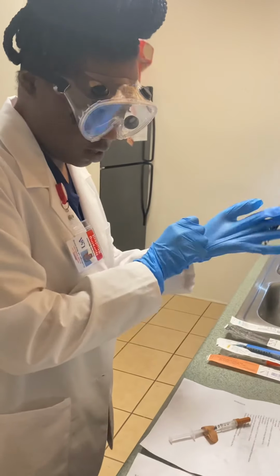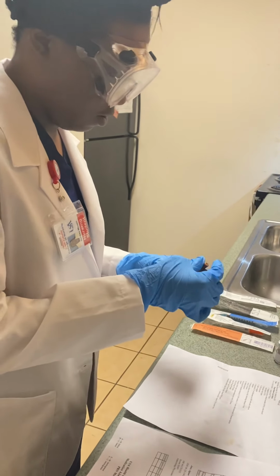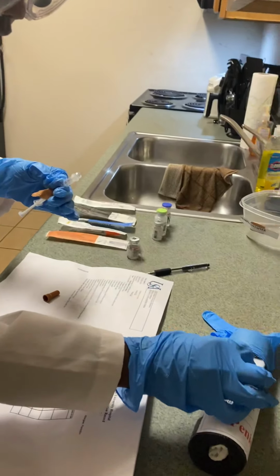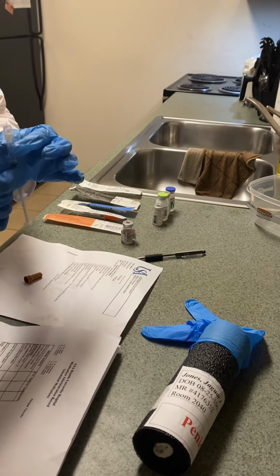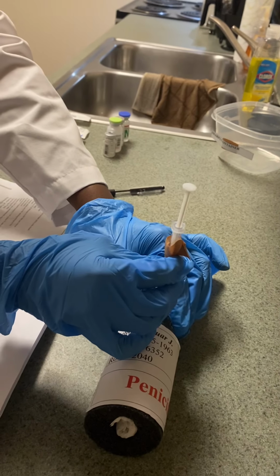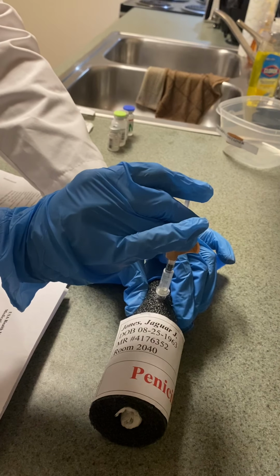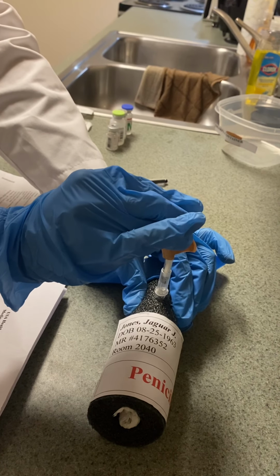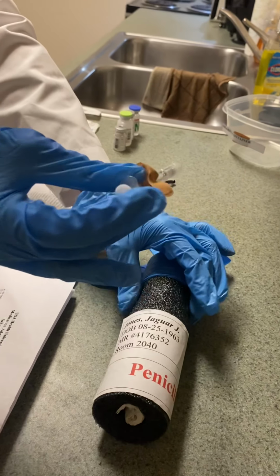So for subcutaneous, I'm going to be pinching the skin. And once again, I did not have any alcohol wipes, so I'll be using these over here. So I would just wipe down the insertion site, and I would throw that away. And I would pinch the skin and go in at a 90-degree angle here. And I would administer my 0.5 milliliters over the skin, and we're done.